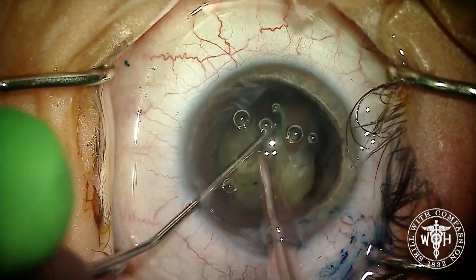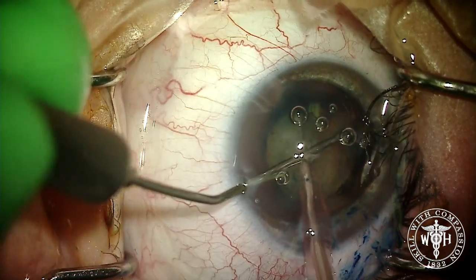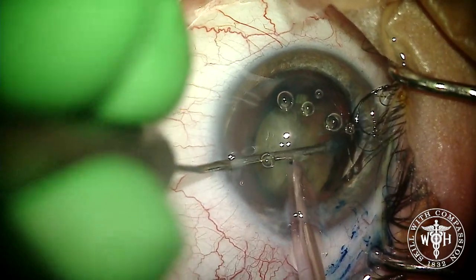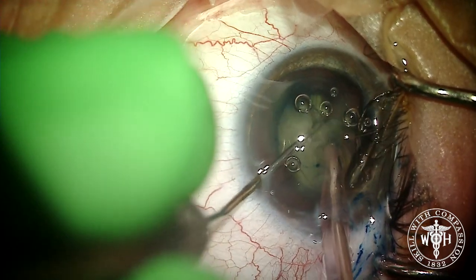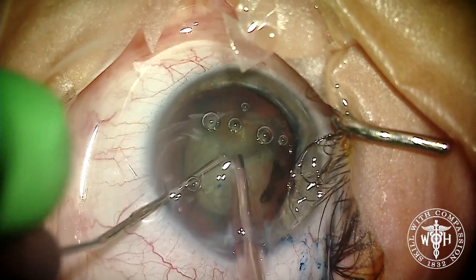Truth be told, I probably could have gone in and divided this one more time, but you can see a nice subdivision without doing any phacoemulsification. Now I can get into that fracture line and cross-chop this lens, getting three or even four pieces before any phacoemulsification has started.